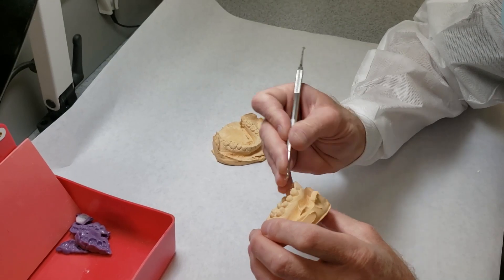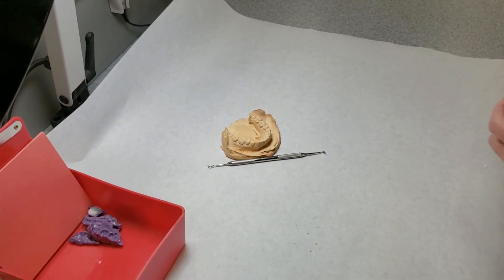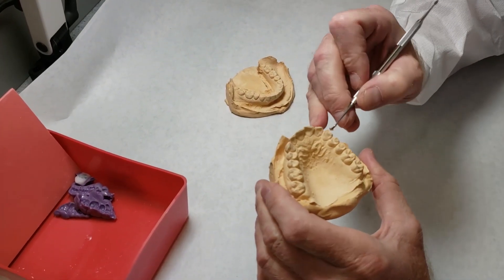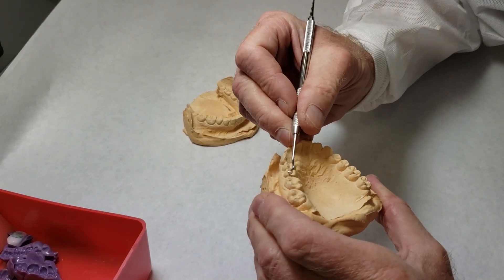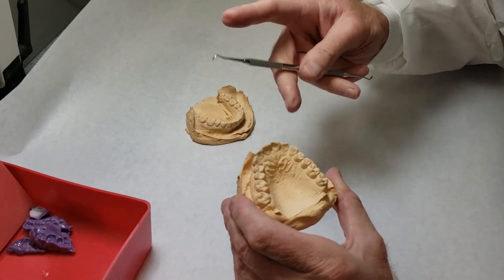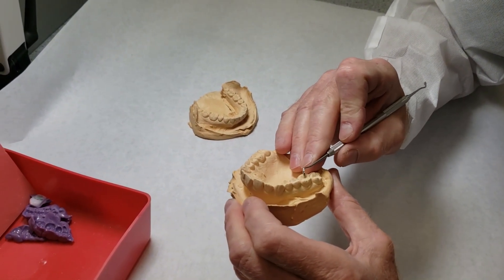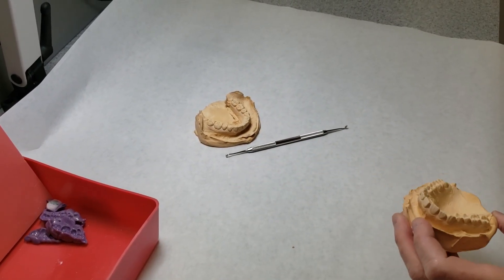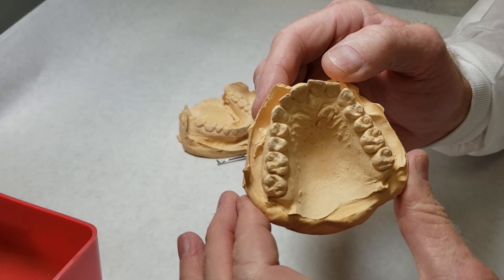A little bit more right there — let's see how that looks. Still not real happy with this right in there. This is looking better. There's a little one right there, and another one over here. Take a little time at this stage and it will pay dividends in accuracy down the road. That's got the upper cast. Now it's time to trim.